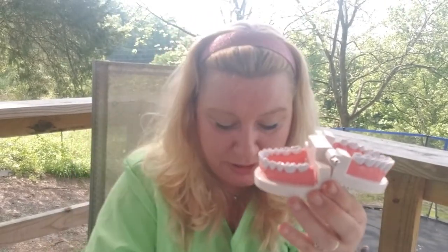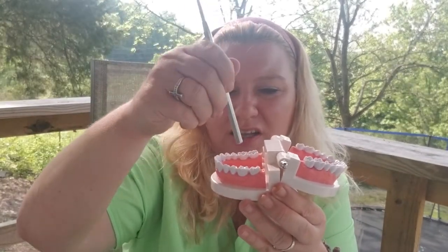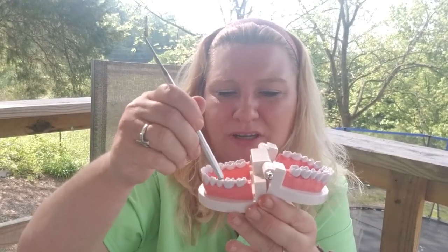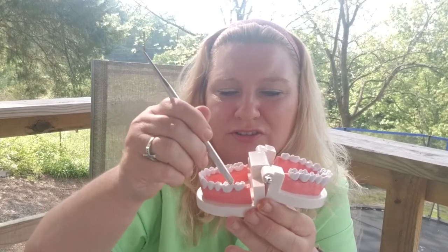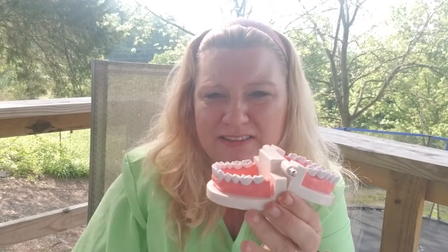They will take a mirror, use the back of the mirror, and say, 'Is it one, is it two, or is it three?' and they'll do it again. If the patient says it's the same number, it's the same tooth. That's how they can check the nerve of the tooth to see if it's dying.